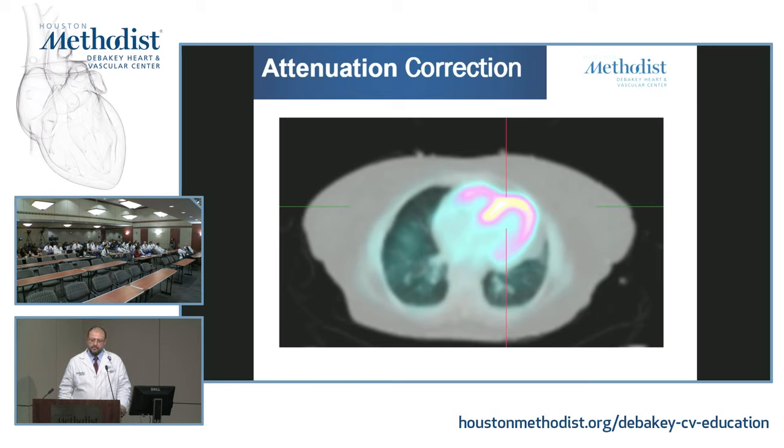I don't want to belabor this just because there are some false positives and false negatives. The question is, validation with the newer system, how comfortable are you with it? Meaning, are we more on the sensitivity or more on the specificity side? The same discussion happened when we transitioned from 2D to 3D. There are some people, even across the street, who still don't believe you can do a good PET flow with 3D, and they're still using 2D.